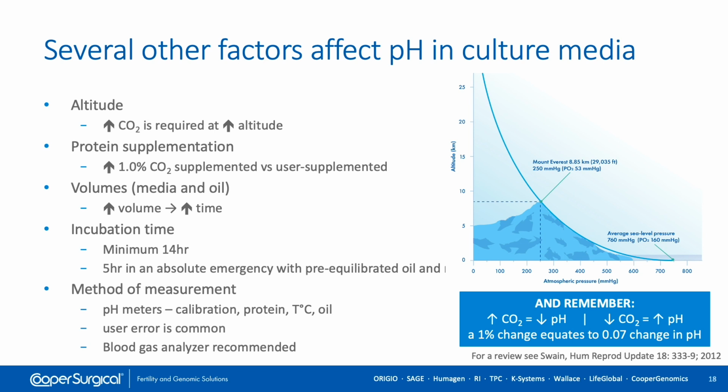How do we measure pH? Well, of course, this has been a conundrum for many labs over many years, but there are pH meters that are designed for IVF labs, but they require calibration. The protein concentration can have an impact, the temperature that you do the measurements, and also the presence of oil.